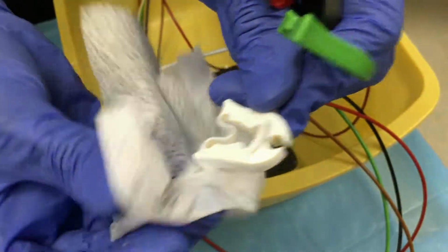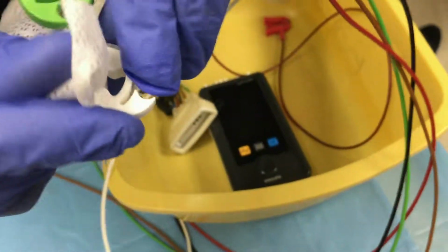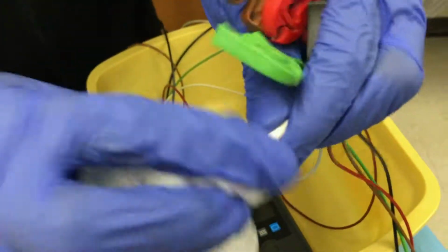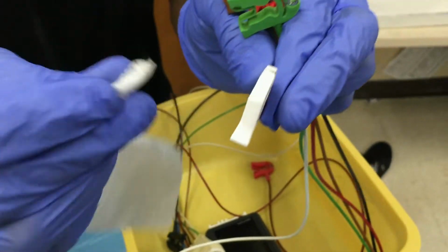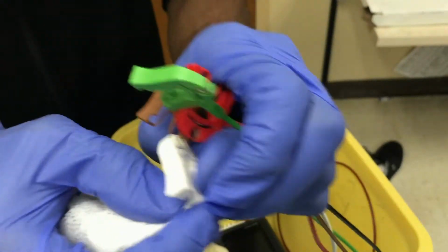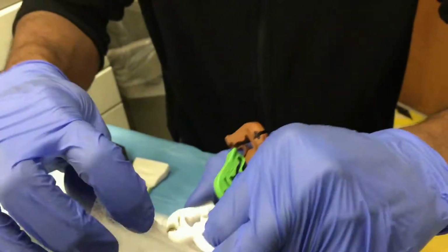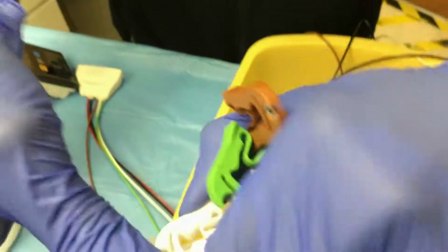Start by cleaning the outside of each piece, then fold the Cavicide wipe to fit in between the spaces of the chest leads. Slide the wipe in between these spaces to remove all debris hidden in these areas. You can use the edge of the wipe to gently slide in between the tighter spaces. Next, fold the wipe again in a new section of the wipe and clean in between the grabbers of the chest leads, as debris is often hidden in these areas as well.